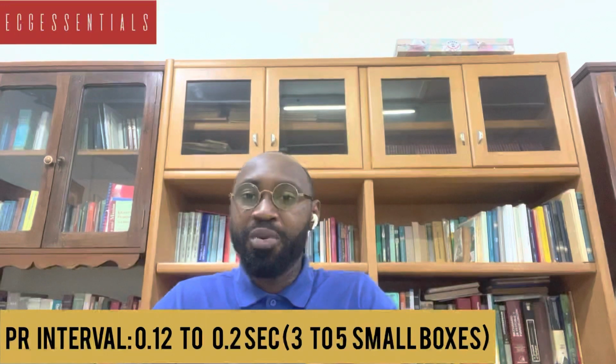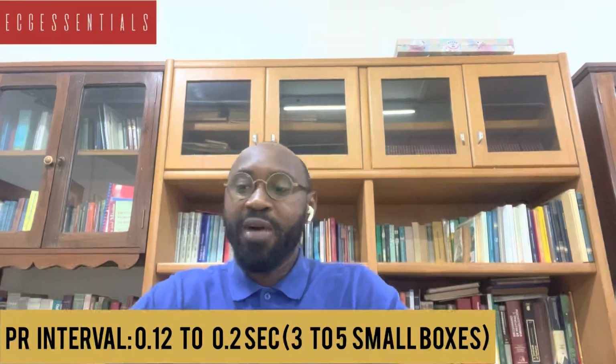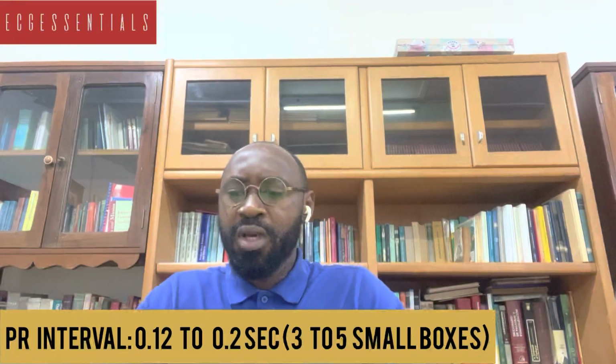So apart from the P wave, the PR interval will have to be discussed again. The PR interval, we said, represents the time from atrial depolarization to the start of ventricular depolarization, and it includes that delay in the AV node.